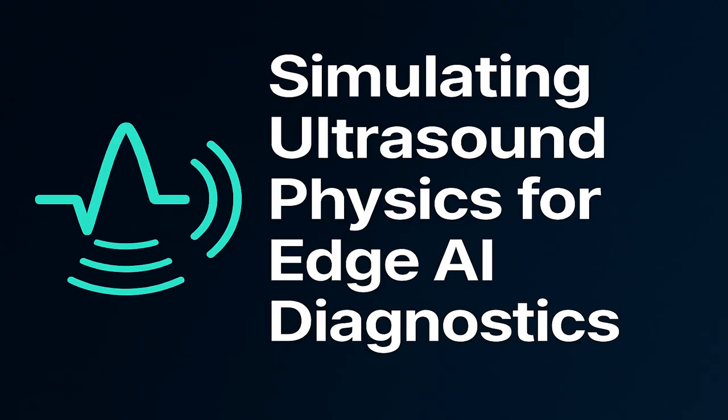In theory, yes. But sampling at 8x provides substantial numerical stability for all the signal processing steps that come later, especially when you're dealing with wideband pulses, which you always are. It also greatly simplifies the design of the digital anti-aliasing filters. So what does that mean in practice? How many data points are you capturing? It means we capture exactly 8 digital samples over the course of that single 200 nanosecond wave period. That gives us exceptional fidelity for the raw signal reconstruction.